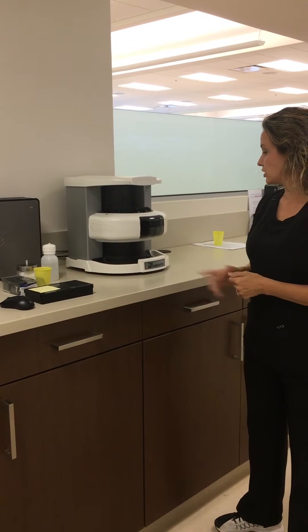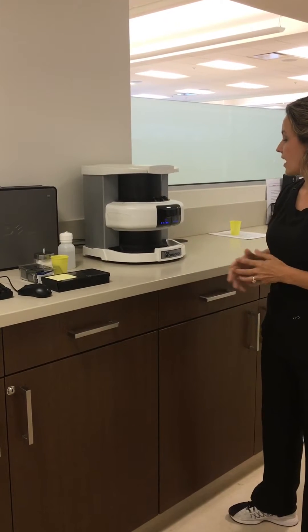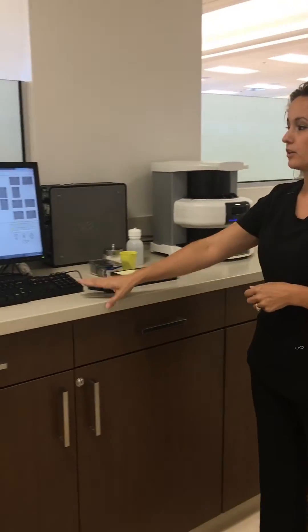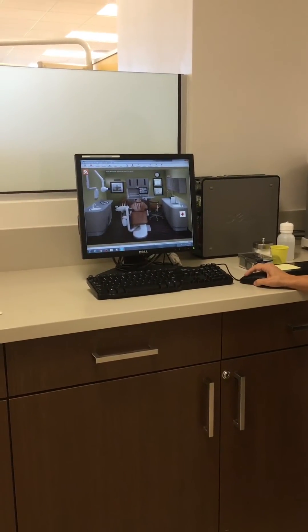The first thing you need to do is turn it on. There's a power button right on the front, and when you press it, the power and the eraser will light up in blue. The next thing you're going to do is log into the adjacent computer and log into your patient's chart in EagleSoft.